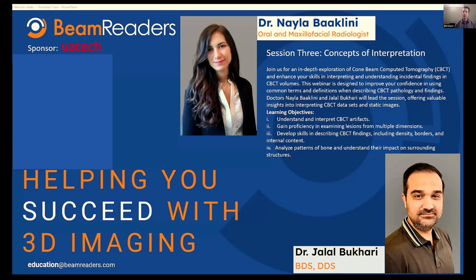Yeah, and just a brief overview of what we're looking at today. This will be our third session. The first session started with a basic review of a scan and understanding the workflow of going through that. Session 2 was more about looking at anatomy. And now this session 3 is going to be concepts of interpretation and what we are seeing. So gaining more of an understanding of artifacts, looking at different lesions and patterns of bone and things like that. So I think we have a lot in store for everybody today.